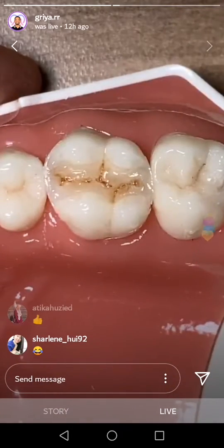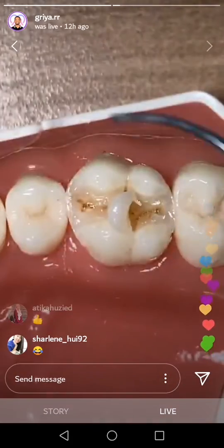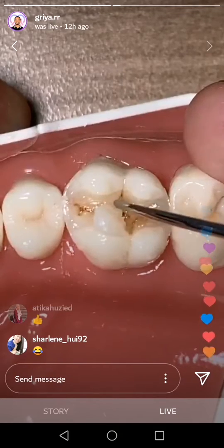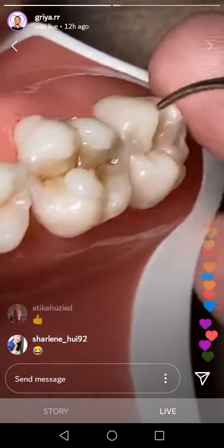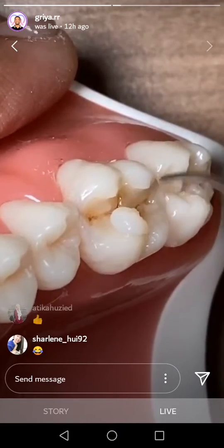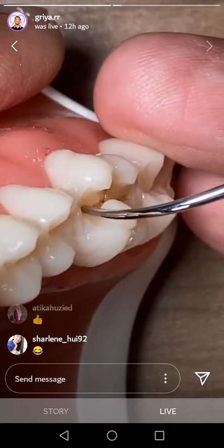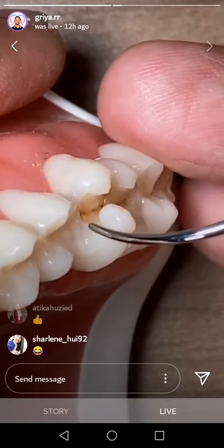Okay, so just add like this, and then wipe your instrument with the alcohol swab. Make sure it's clean, and then I will show you the technique, how to push the composite. The movement is not like this, this is wrong. You need to follow the curve, step, step, step. Don't do this, this is only pushing from the top down. You need to follow this curve, okay?